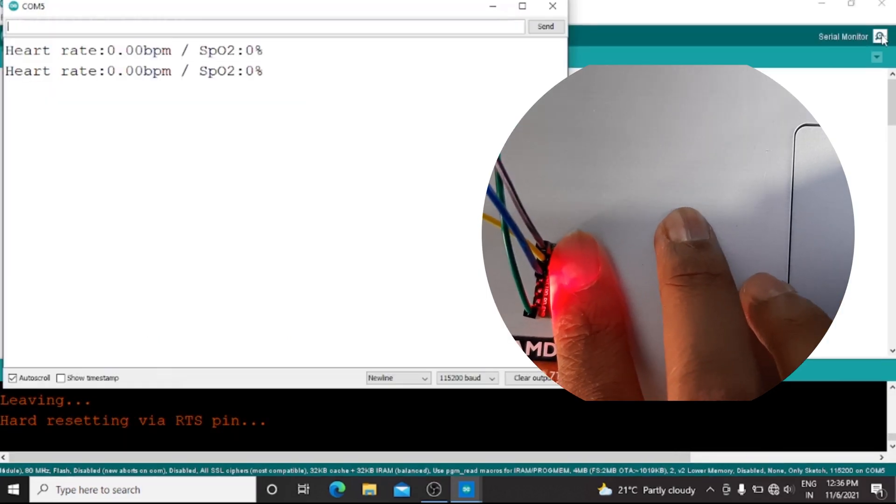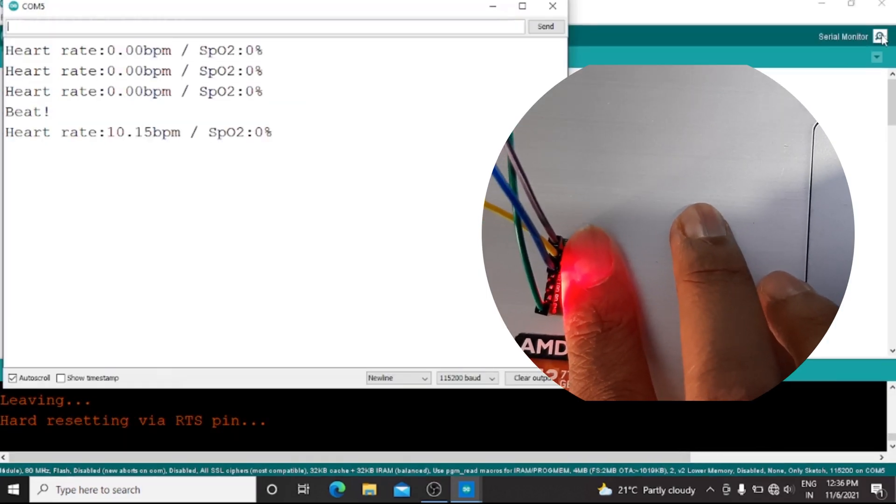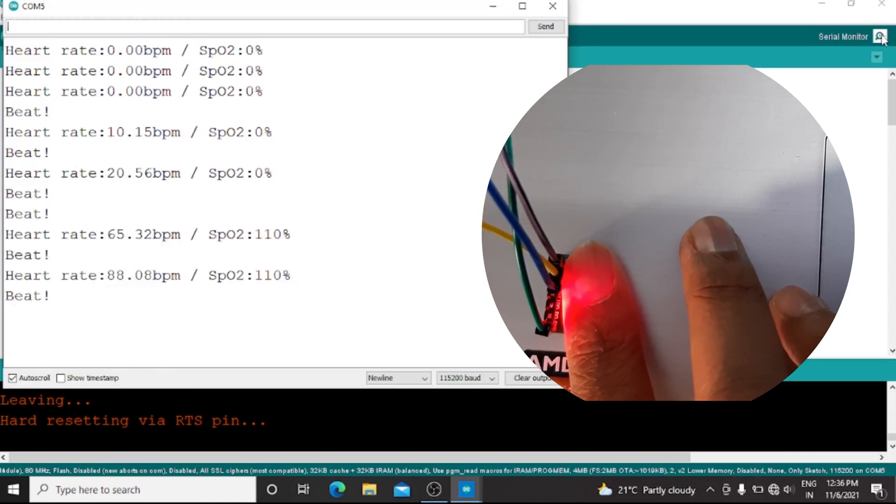Now press your fingers on the sensors and we have obtained the results.